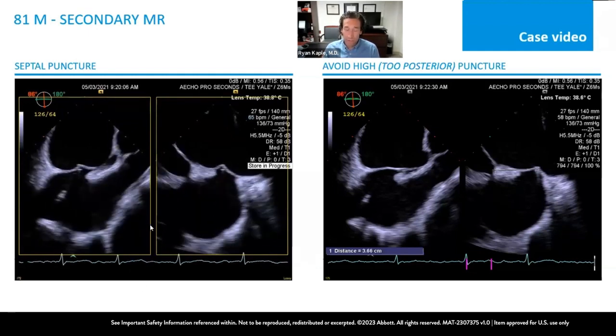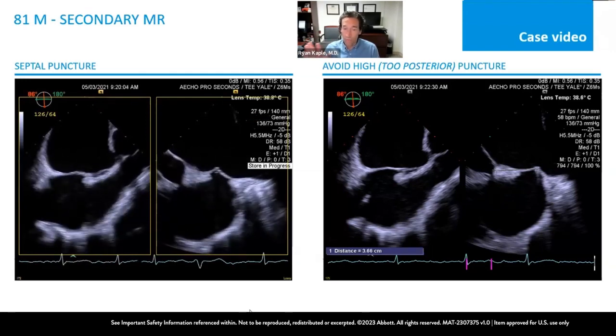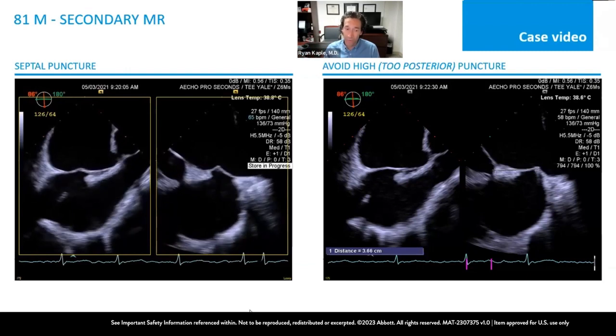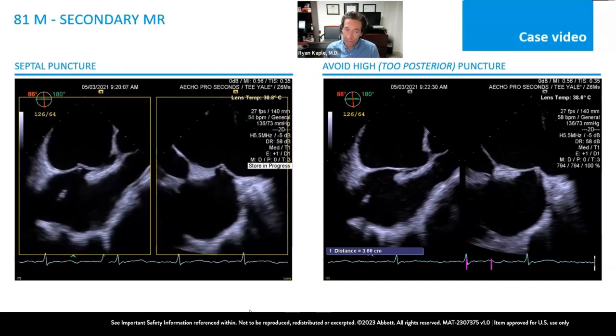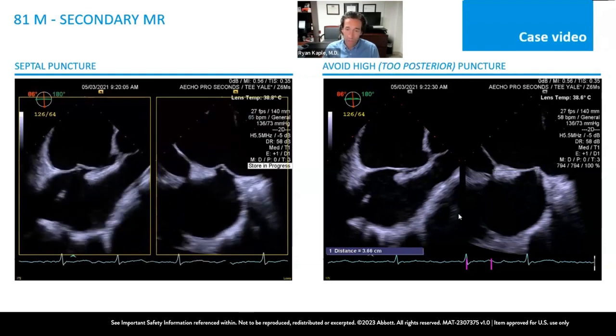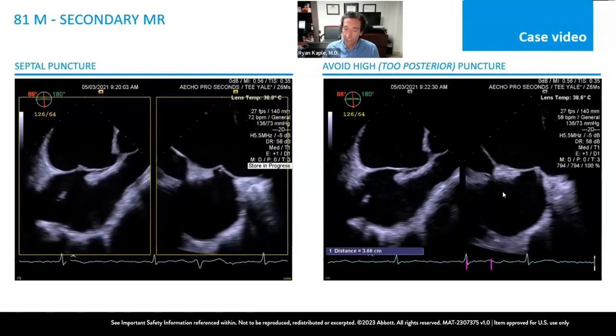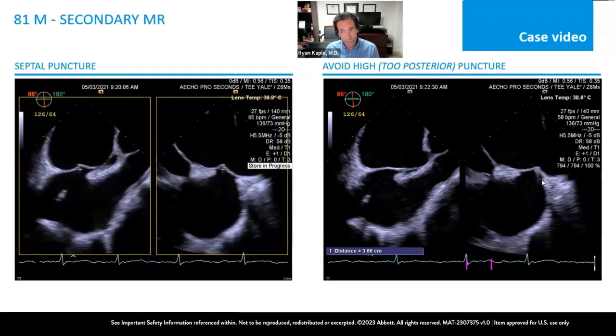So in this image, on the picture on the left that's moving, all the way to the right is posterior. And so you can see that I can probably get a little bit better in terms of posterior. And so when you look at the image on the right, the still image that demonstrates the height of about 3.6, I've made my way more posterior.